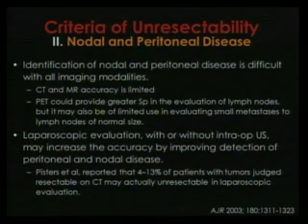There are some publications that say that they can do intraoperative ultrasound for evaluation of nodal disease or for evaluation of any other implant. And some people are getting advantage of this modality.